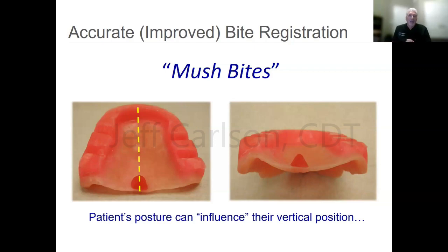Well, here's something that Dr. Frush shared with me: when we go into functional closure, meaning there's something between the arches and we're closing into it, let's say some bite wax, and there's some resistance, the condyle not only can sometimes go a little bit up and down, but can do some shifting.